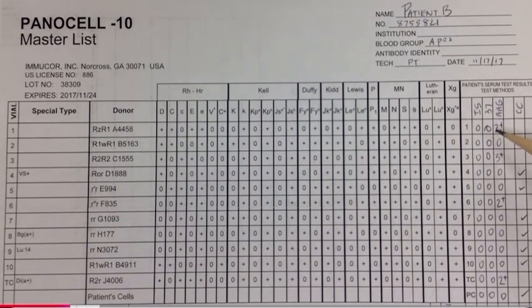We can see in our reactions here that we have no reactions at initial spin, no reactions at 37 degrees, and then we have all of our positive reactions at the AHG phase. So as we recall, initial spin is generally where we tend to see IgM or cold or room temperature antibodies, so it doesn't look like we're dealing with any of those. And it looks like we're probably going to be dealing with IgG, because IgG tends to react at 37 and more specifically at the AHG phase. So we have 2+, 3+, 2+, and 2+.